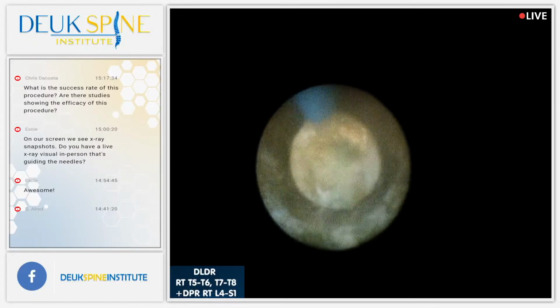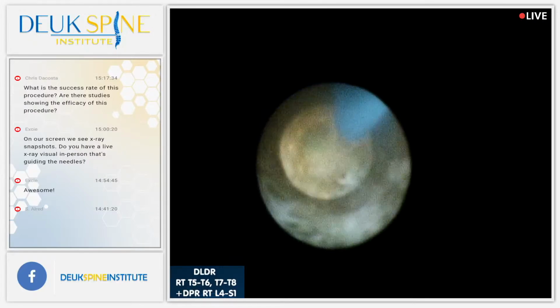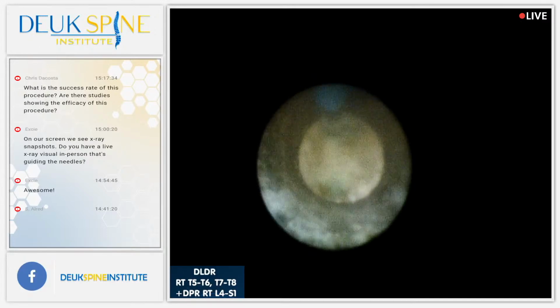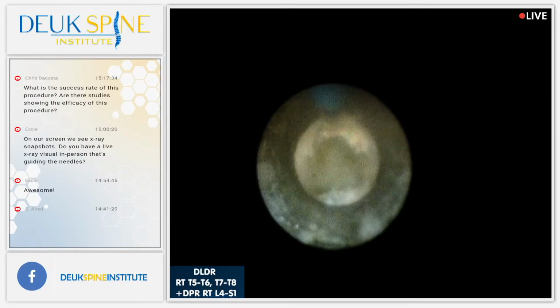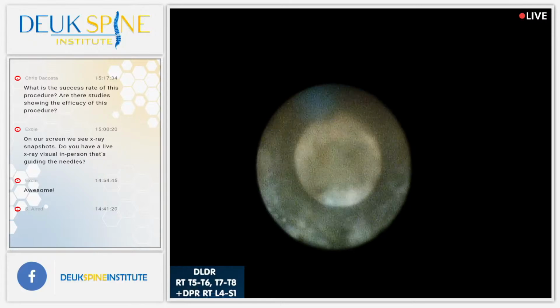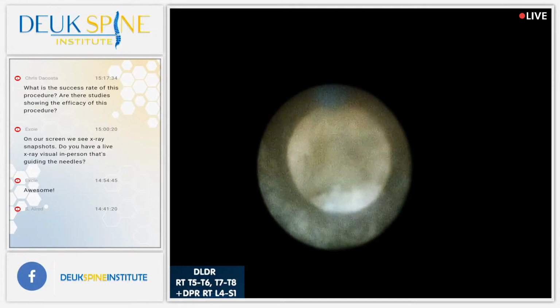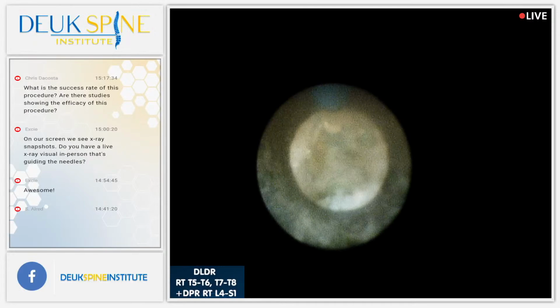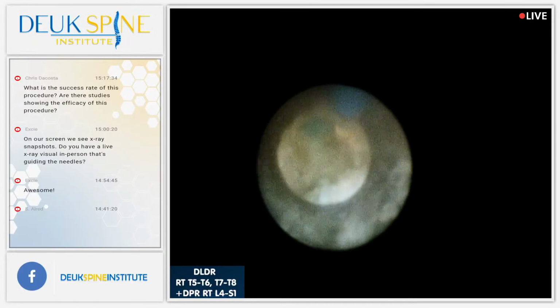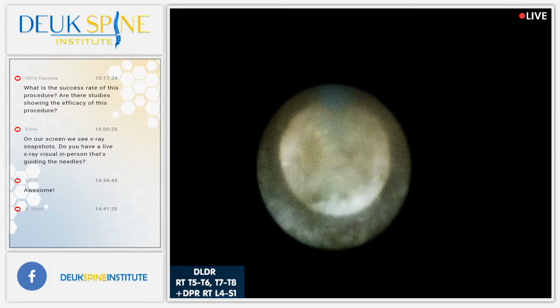So anyway, surgery is going well. We're removing the herniation quite nicely. There is some scar tissue in here from chronic inflammation. And just for the record, for the 5-6 disc, I wasn't able to get in because of some abnormal bone on the side of the spine. More importantly, I don't know that the patient's having pain from that disc, because where she mapped her pain out before surgery, it's not consistent with that location. When I asked her before we put her to sleep, do you have pain up here? She said, a little, very mild.